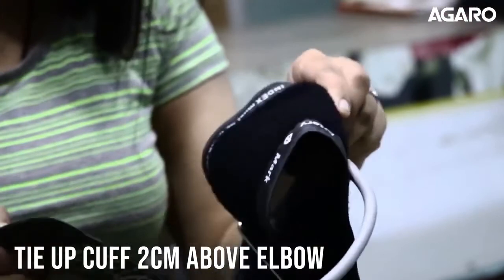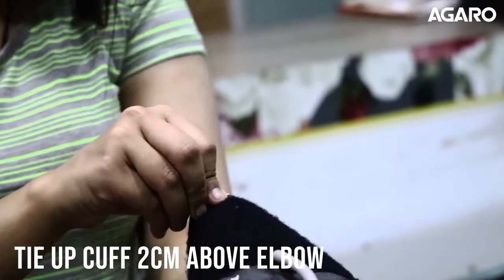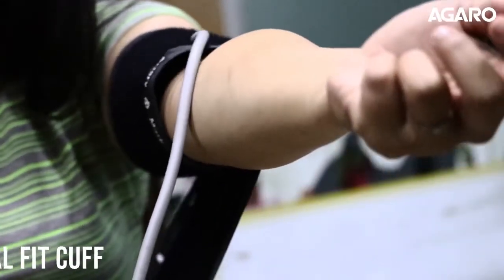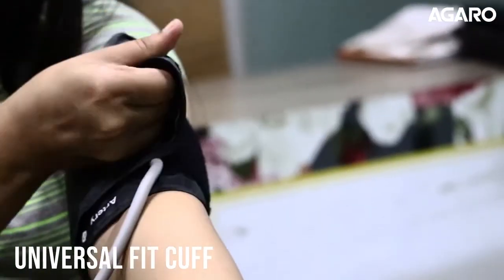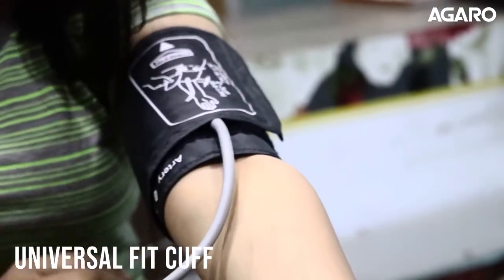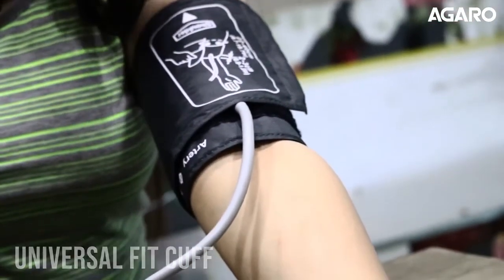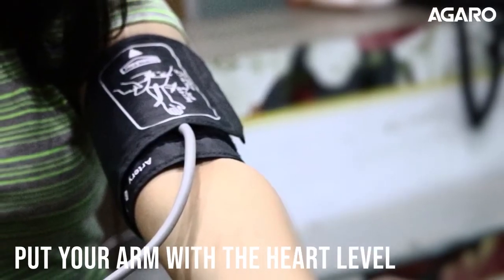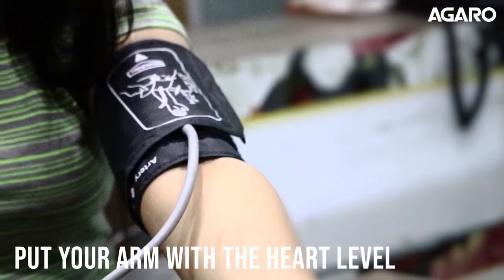Open the cuff and place it on your left upper arm around 2cm above the elbow and secure the cuff for a snug fit. The large sized cuff is extremely comfortable to wear and fits mostly on all arm sizes. Attach the pump cable to the device and put your arm on a flat surface, preferably in line with your heart.